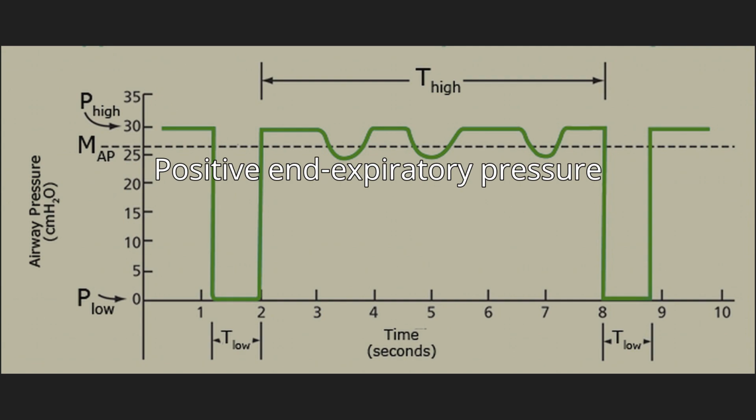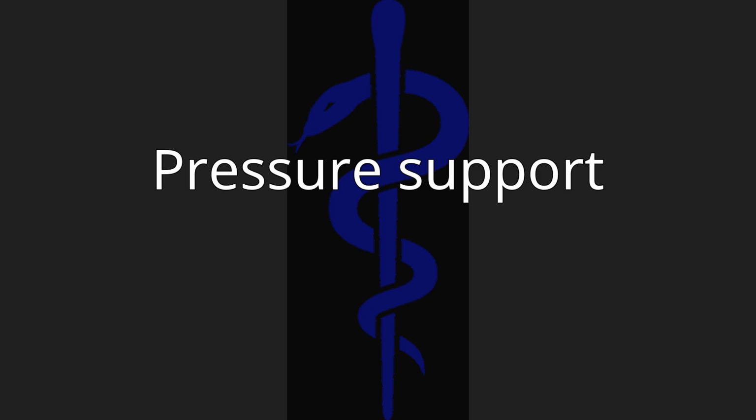Spontaneous breathing and support settings. Positive end-expiratory pressure. PEEP is pressure applied upon expiration. PEEP is applied using either a valve that is connected to the expiratory port and set manually, or a valve managed internally by a mechanical ventilator. PEEP is a pressure that an exhalation has to bypass, in effect causing alveoli to remain open and not fully deflate. This mechanism for maintaining inflated alveoli helps increase the partial pressure of oxygen in arterial blood, and an increase in PEEP increases the PaO2.